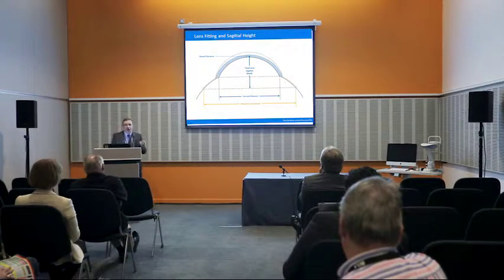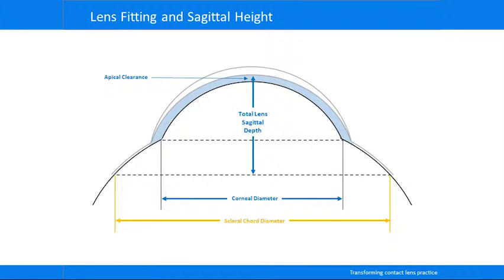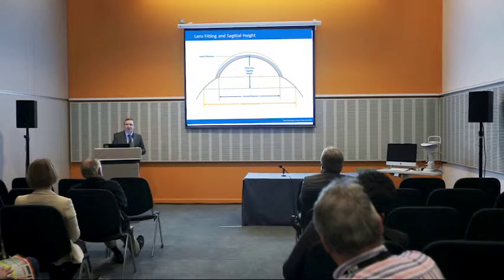So, the ability to be armed with sagittal height information gives us an awful lot of extra data, and that's one of the areas where the ESP really does excel. I just wanted to move away for a second.